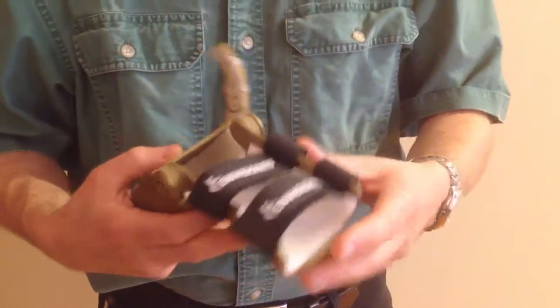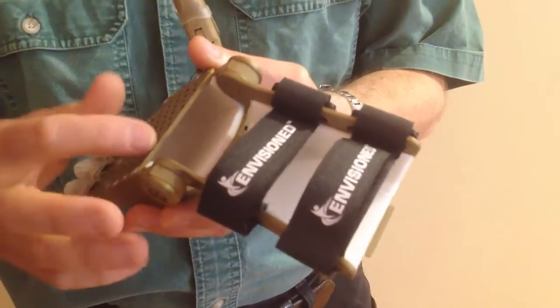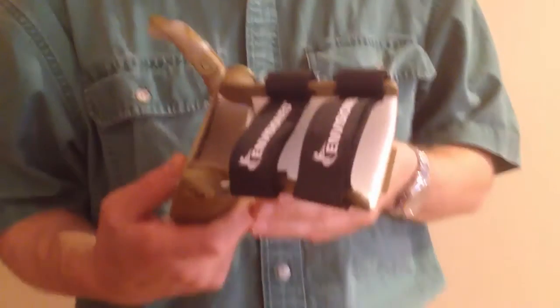Let's take a look underneath. The gauntlet and the palm both have this surgical grade foam attached to them. Make sure that the foam has been trimmed neatly on all surfaces and all edges, and that there's no ragged aspect to that. It should all be nice and neatly trimmed at the ends.